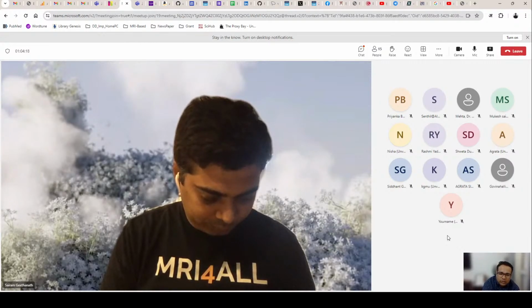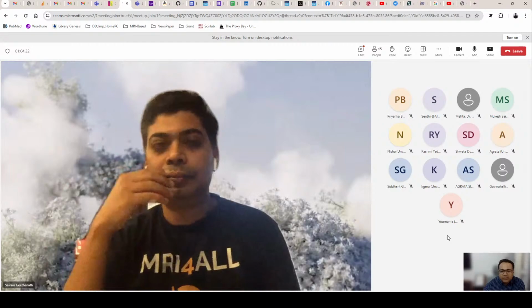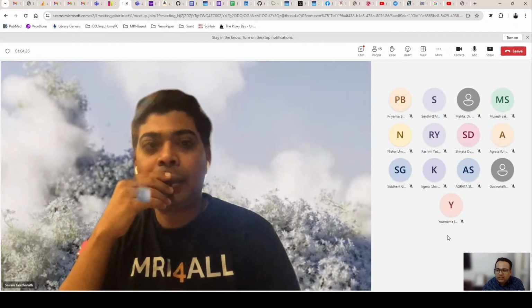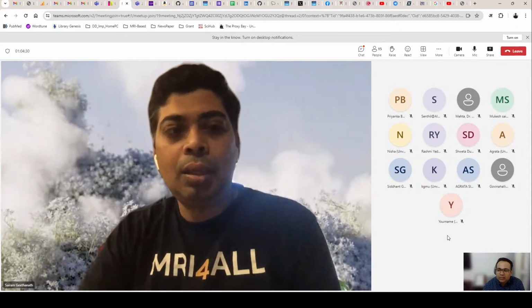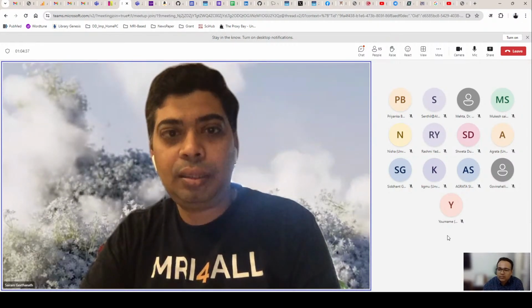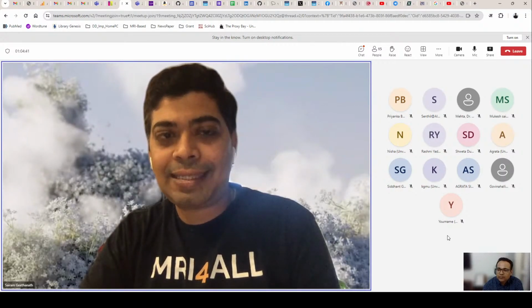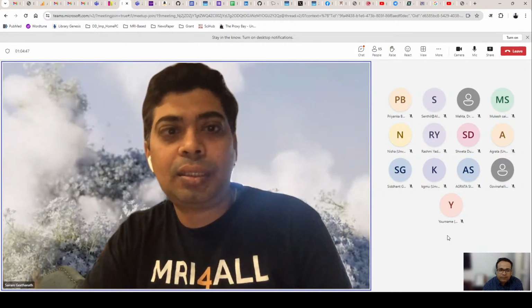Do you suggest any other open source platform like yours, which can also be used from a teaching point of view? I know there are a couple of Bloch magnetization tools by a group in Germany. So yeah, that's a great question. In the article we've actually compared existing software. There's a table. Let me just see if I can pull that out.